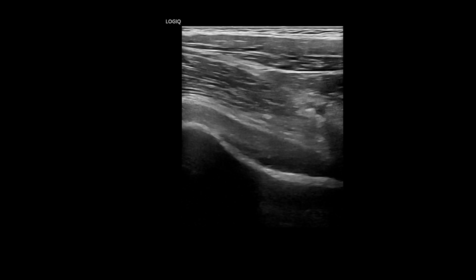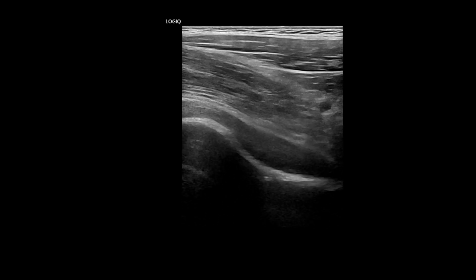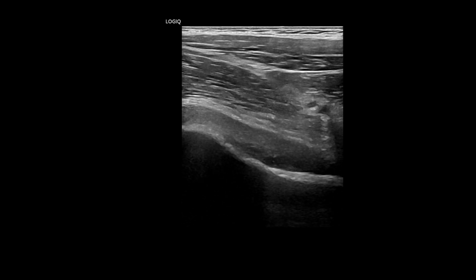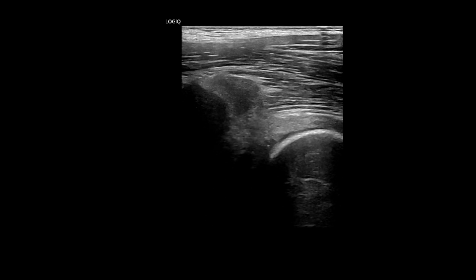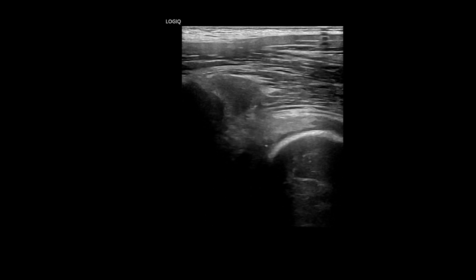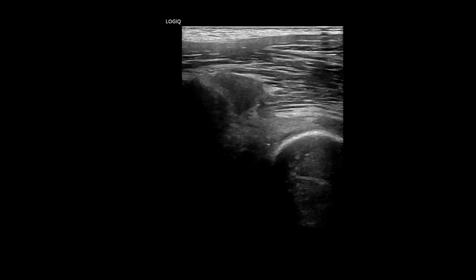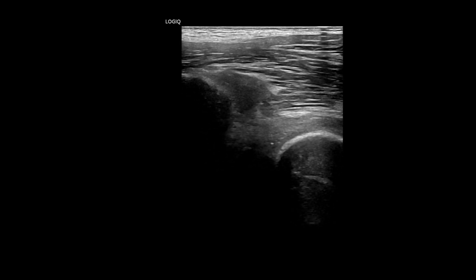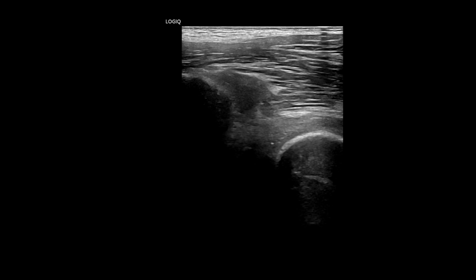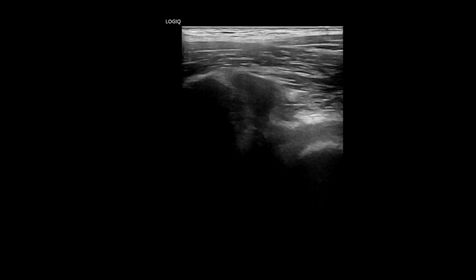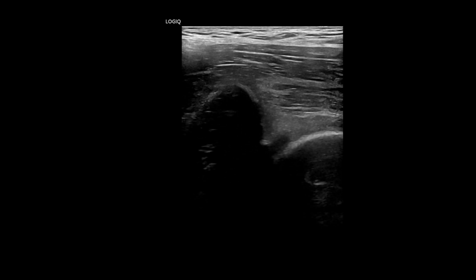When scanning the hip joint with ultrasound in an adult patient who complains of persistent hip pain, do not dismiss the presence of joint effusion. This effusion in adult patients is not a benign or incidental finding. In contrast to pediatric cases, where transient effusion is often self-limiting, hip joint effusion in adults is abnormal and should be treated as a red flag.